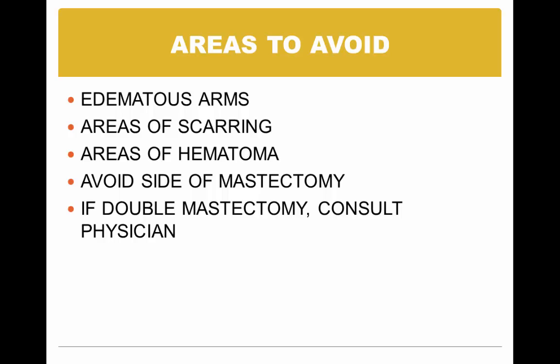If you can't use another site, you want to draw distal. Think about what distal is. Distal to the hematoma. Mastectomy patients: there is the potential for harm to the patient due to the stoppage of the flow of the lymph fluid in the arm on the side of the mastectomy. That's why that arm should be avoided.